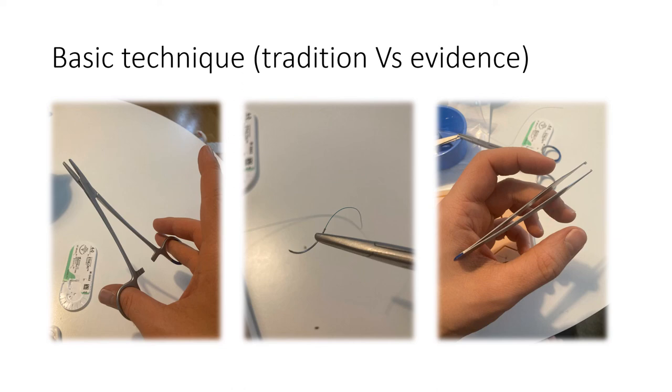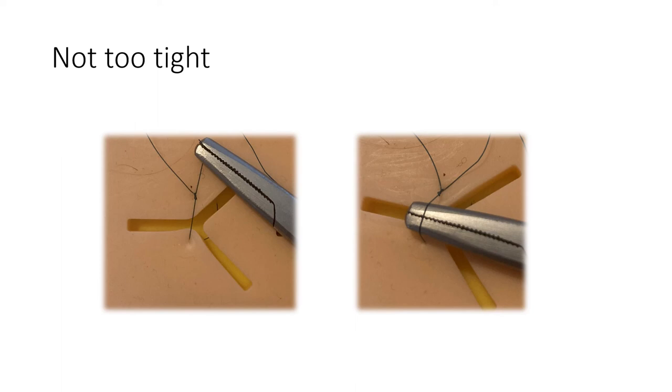The way you hold your tweezers is like this: you stabilize the entire thing with your third finger and the pocket here, so you don't have to hold it with your tweezer grip, with your index finger and your thumb. This is stabilizing it, and this is how I was taught it anyway. Okay. Then what we are doing when we're suturing is trying to approximate the skin edges. If the patient has really thin skin, or is on prednisone, then sometimes it's impossible to suture, and you just have to use a Band-Aid or plaster.